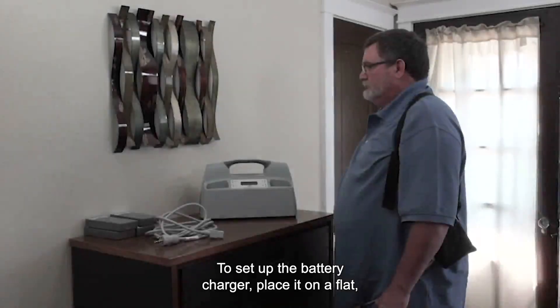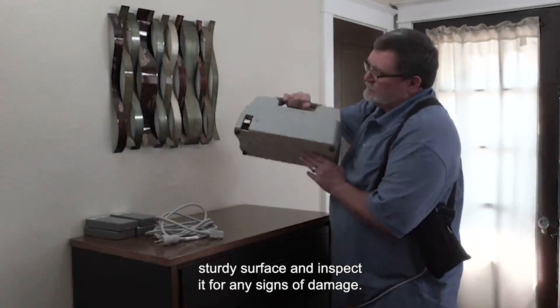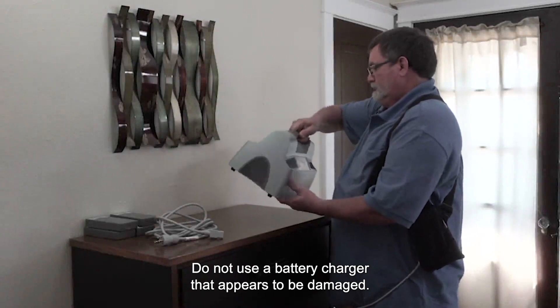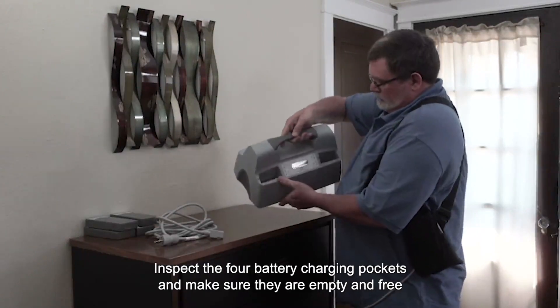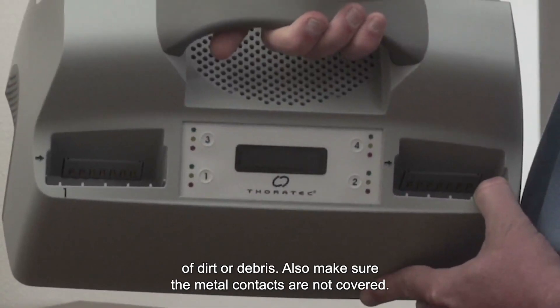To set up the battery charger, place it on a flat, sturdy surface and inspect it for any signs of damage. Do not use a battery charger that appears to be damaged. Inspect the four battery charging pockets and make sure they are empty and free of dirt or debris. Also, make sure the metal contacts are not covered.